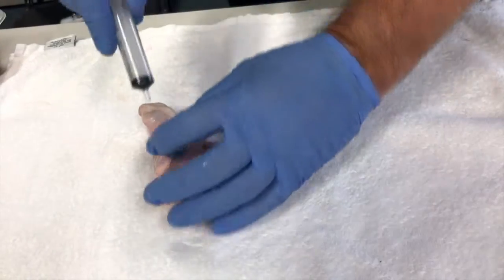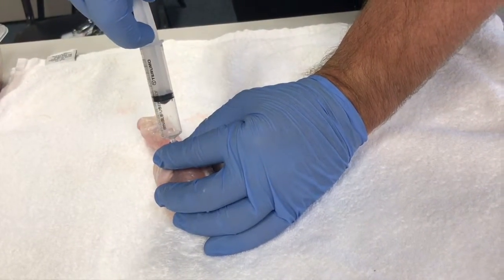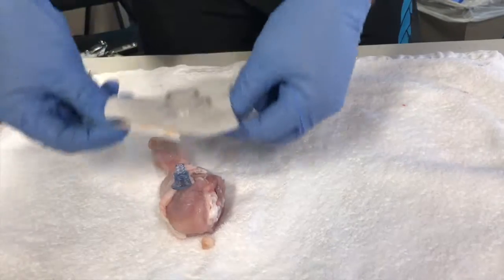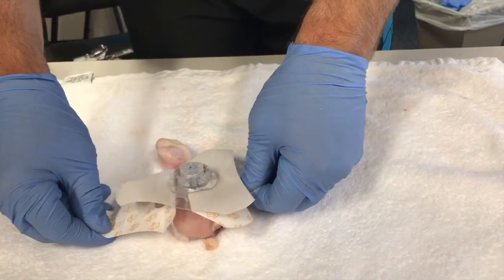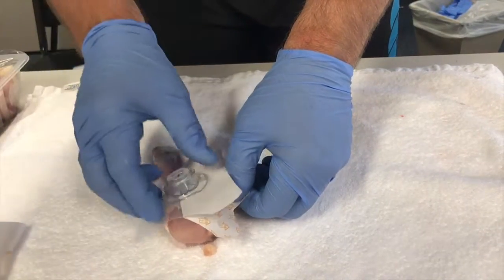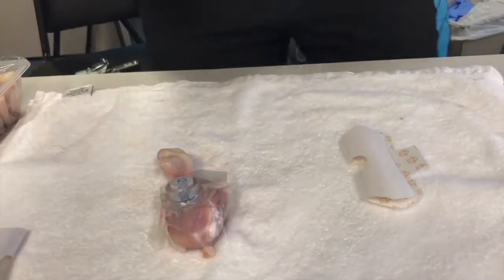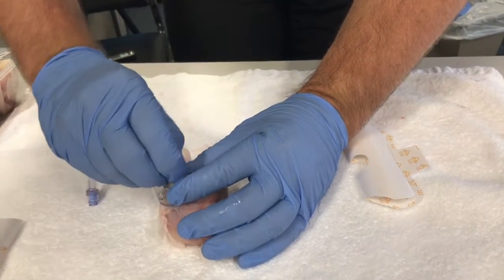Once I've put the needle in, I attach a 10 ml syringe and aspirate the needle. Once I've done that, I attach my securing device over the top like so, and pull on both sides. Next, I grab my extension tubing, screw it into the needle.